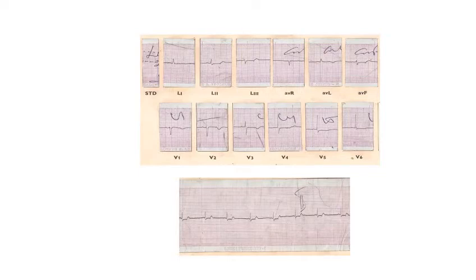One of the conditions in which the ST segment is prolonged is ischemia. Another is patients with hypocalcemia. Patients with hypocalcemia and ischemia can have ST segment prolongation. Is this patient having an arrhythmia? Do you think that there is an abnormality here?